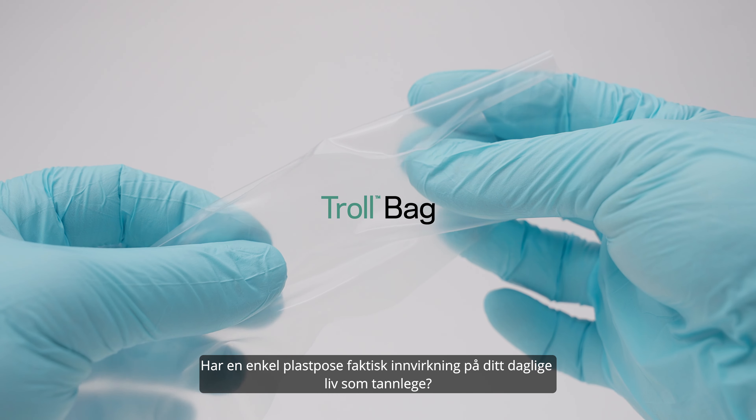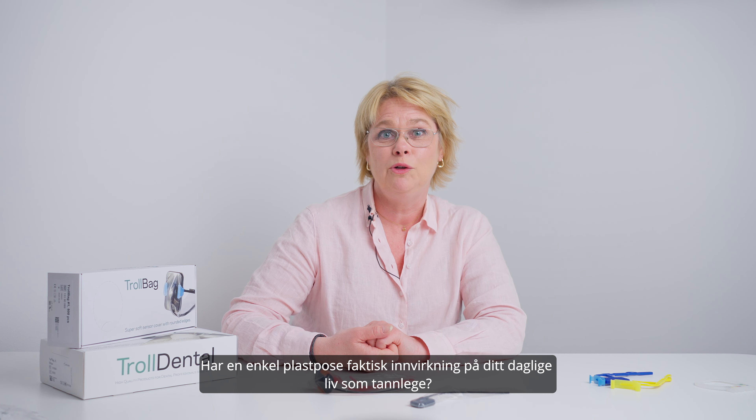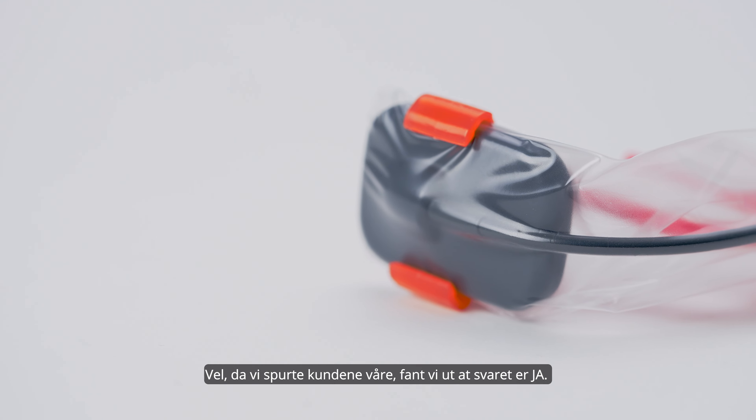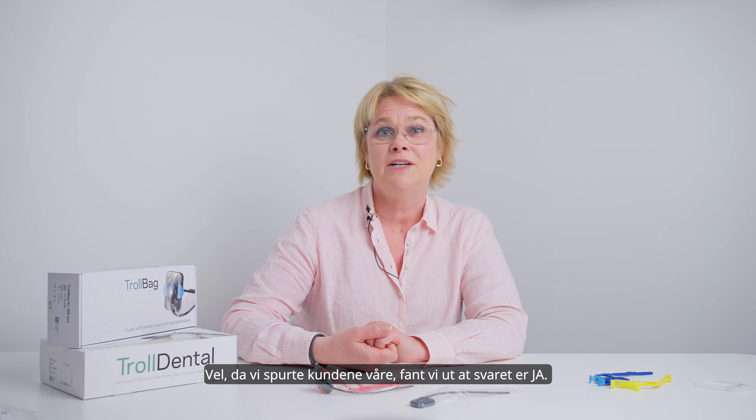Does a simple plastic bag actually have an impact on your daily life as a dental professional? When we asked our customers, we found that the answer is yes.